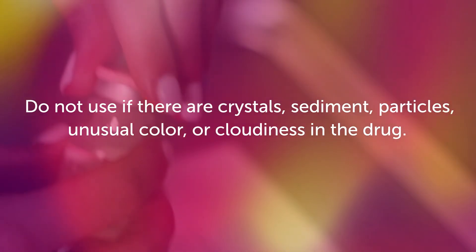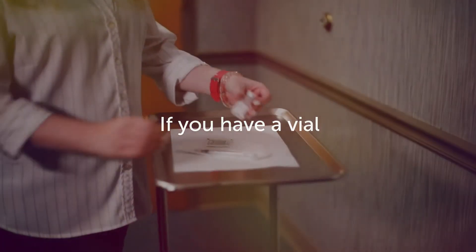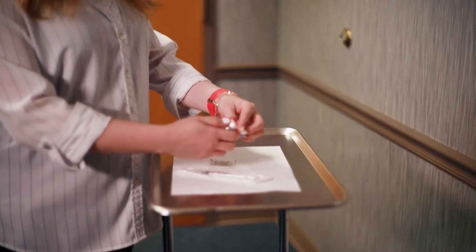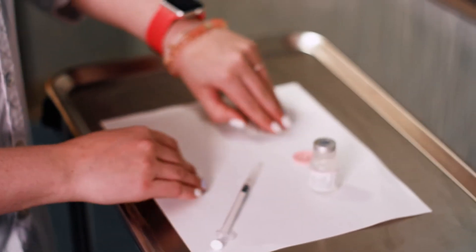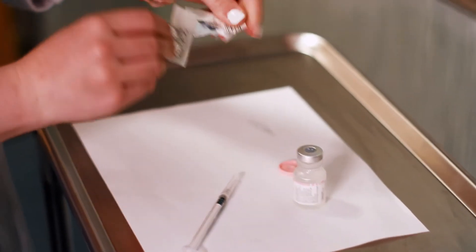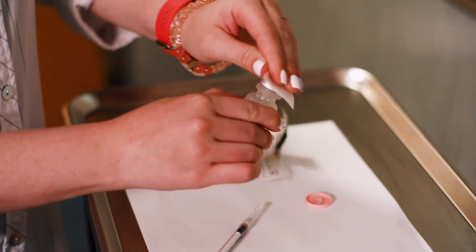Do not use if there are crystals, sediment, particles, unusual color, or cloudiness in the drug. If you have a vial, the first time you use the vial, snap off the plastic cap. Note that it cannot be put back on. Clean the top of the medicine bottle with an alcohol wipe.